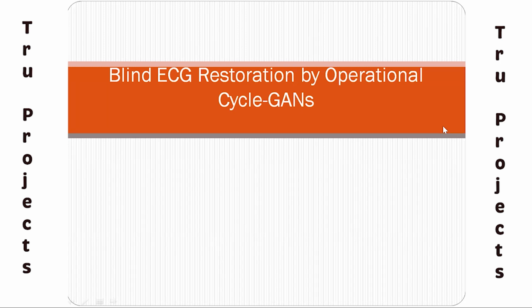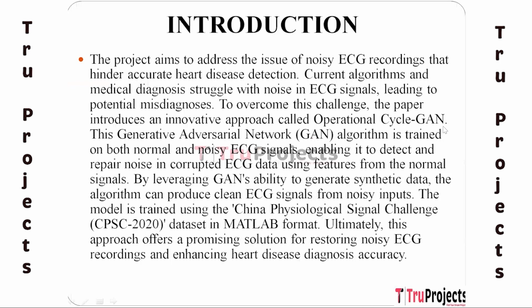In this video, we are going to explain about blind ECG restoration by operational cycle GANs.